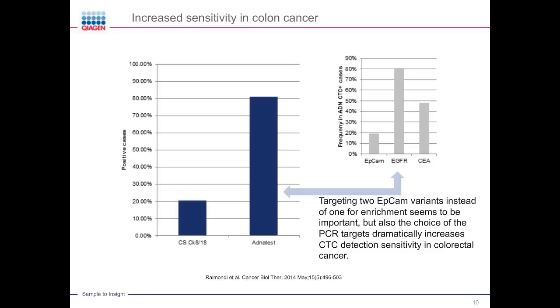I would not say the mixture will not miss here and there a cell that would not have one of the 3 genes or so that we are using here. But I would say in most of the cases, and our results show this quite clearly, at least the increase in sensitivity is obvious.